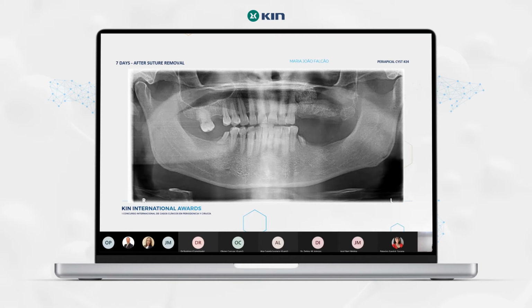And looking at this X-ray, I don't know if you are thinking about what we are going to do next. Well, first of all, we are going to remove the lower roots. They are not good, so they are going to go. Also he had a small decay, and we will treat that. And also the oral hygiene appointment, because the hygiene of the patient was not very good, as you can see in the images in the beginning.